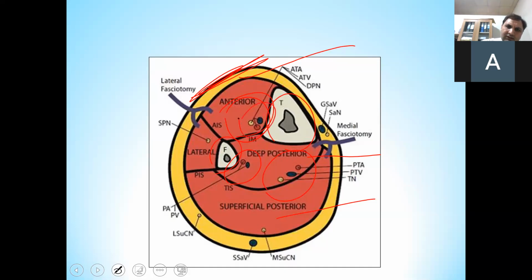So you will have these vessels in short axis. While rotating your transducer like this, you will take access to these vessels in long axis.